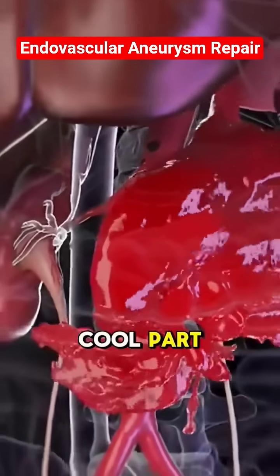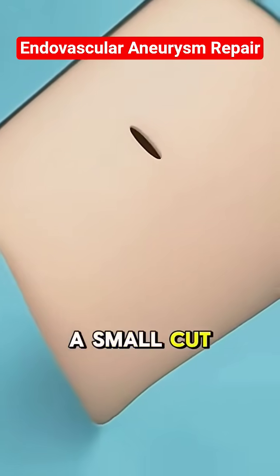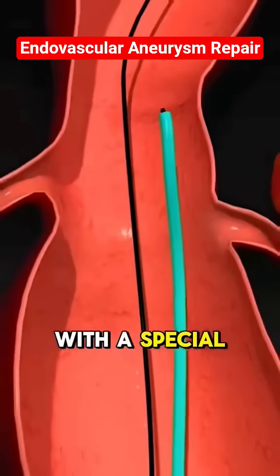But here's the cool part — surgeons don't need to open you up. They go inside the blood vessels. A small cut is made near the groin, and through this they insert a catheter, a thin tube with a special device inside.